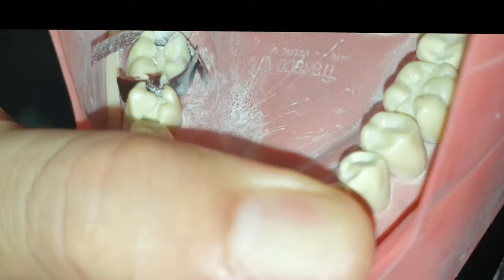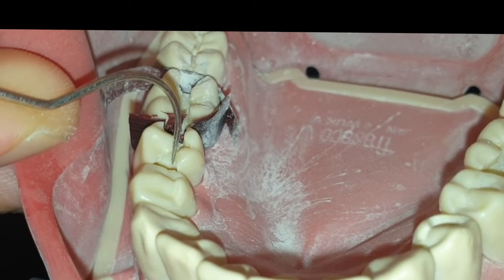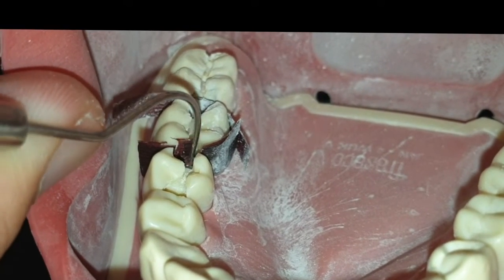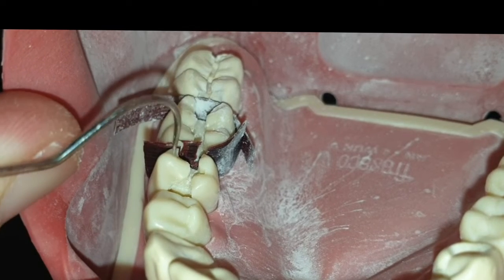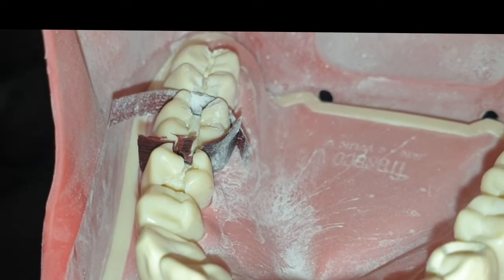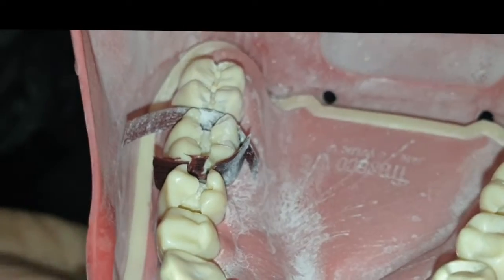So here I prepped my teeth. I'm done — I have beveled all the gingival line angles. Sadly, unfortunately, I tore the sticker as I was turning the corner while smoothing it with the 169 bur. It suddenly went to the distal side and tore the sticker. Aside from that, there was not that strong contact with the proximal. Let's take it out and evaluate it.